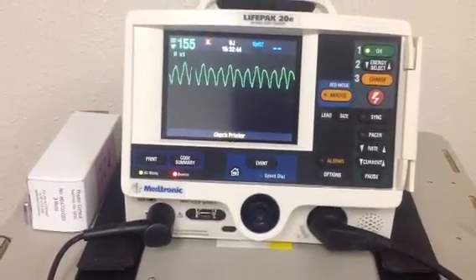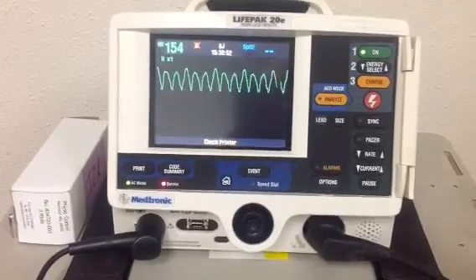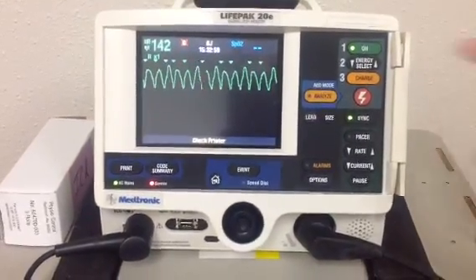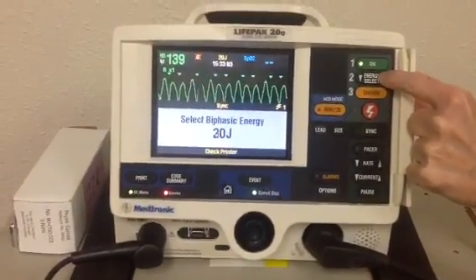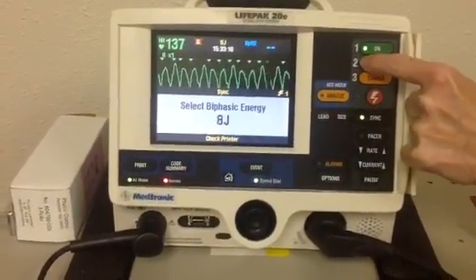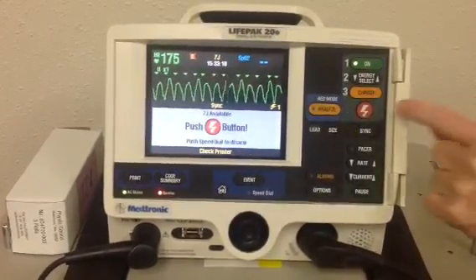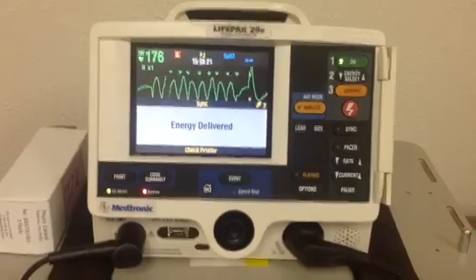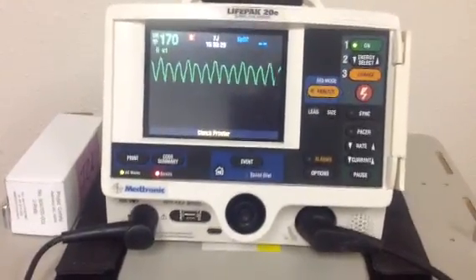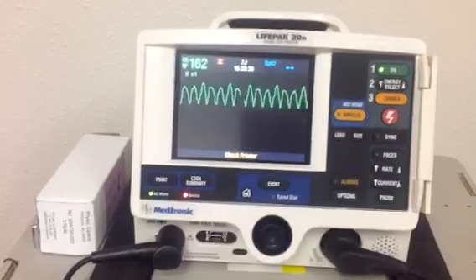So then we would go ahead and follow the algorithm, go up on our joules and do it again. It didn't convert, so we're going to synchronize cardiovert again — we still have a pulse. We've hit the sync button, we're going to select our energy and go up to 150 this time. One, I'm clear; two, you're clear; three, everybody clear. So we just cardioverted. Cardioversion and shock are sometimes used interchangeably, but they are different things. You cardiovert because you have a pulse. We'd want to check our patient at this point to make sure he still had a pulse.